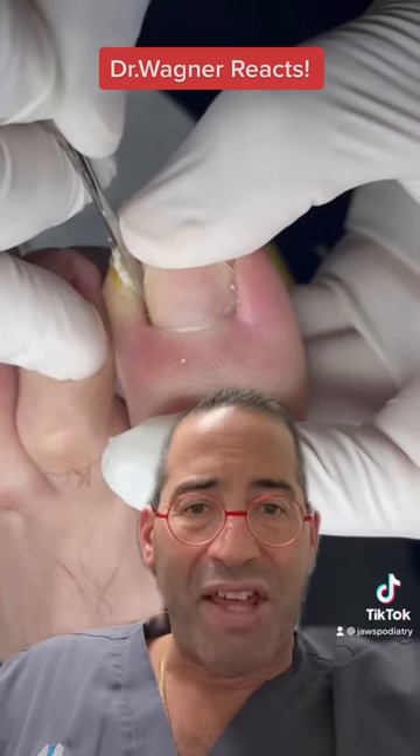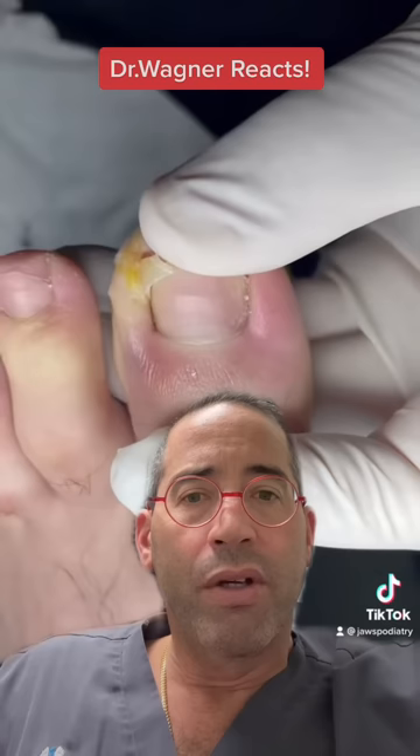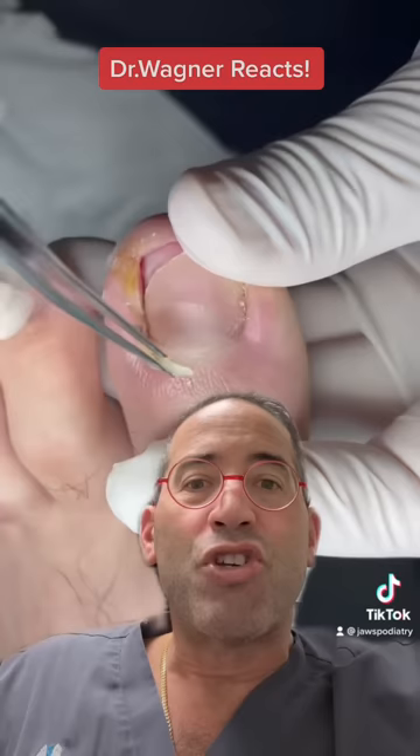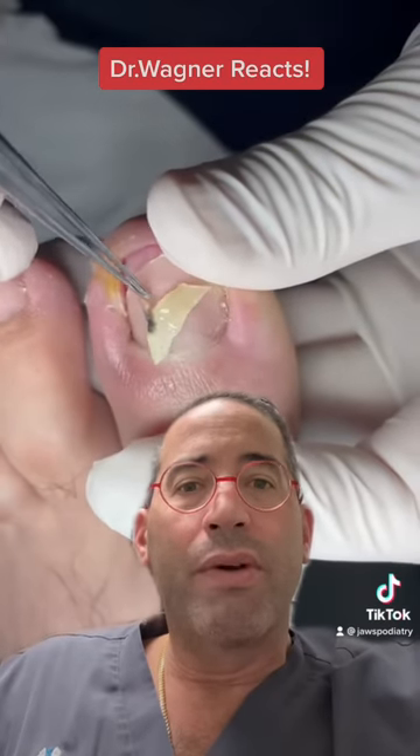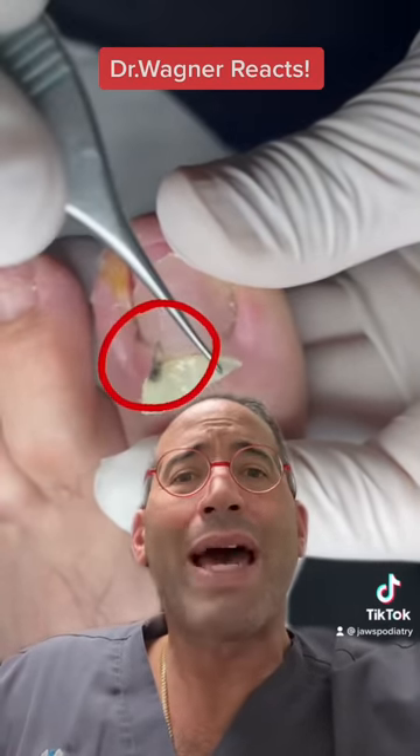All the way back, just like that. I love doing these procedures. Immediate pain relief. And just like that — wow, job well done. Look at the abyss too. Soft tissue adaptation.